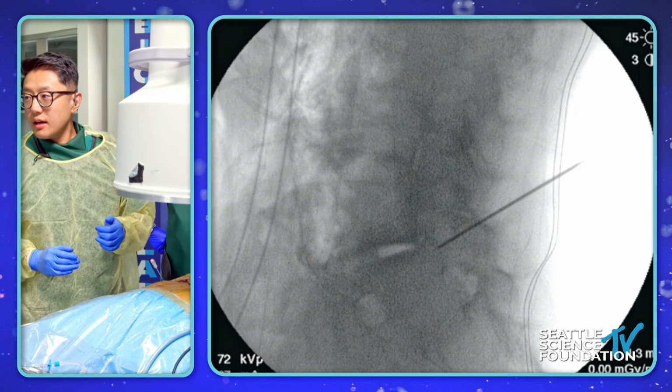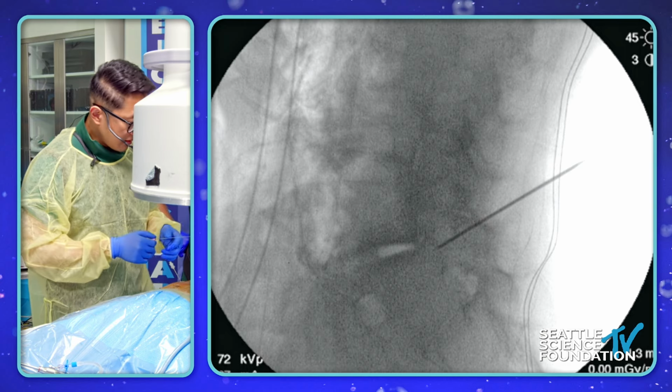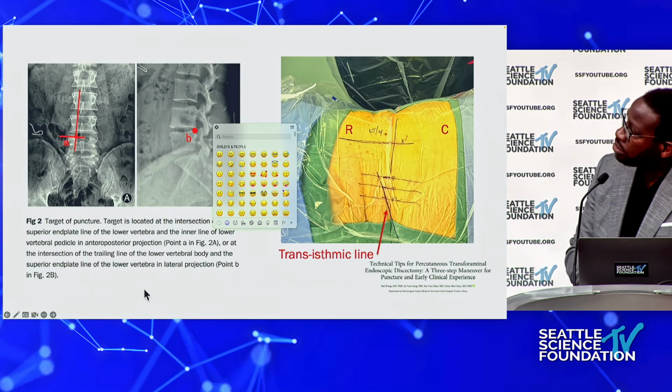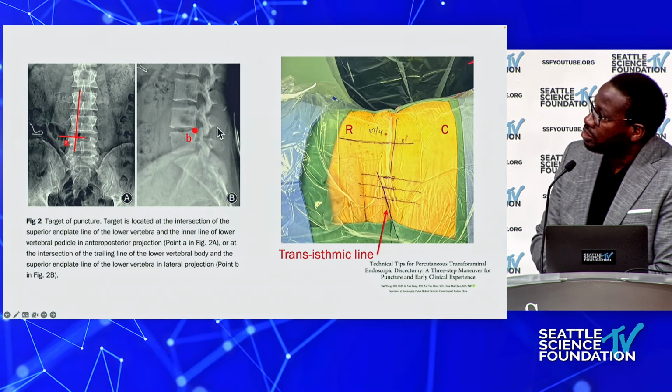Can we quickly switch over to the presentation? So just for the audience, it's a little bit hard to see what Meng has just accomplished. I'm not sure why there's an emoji thing in the front. Let's tilt back to where we were. We need to maintain that tilt.